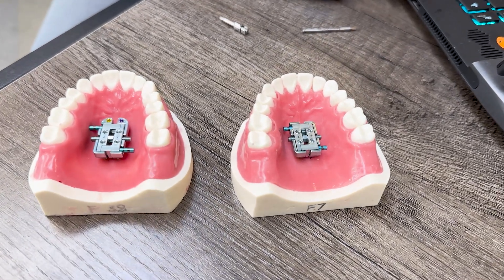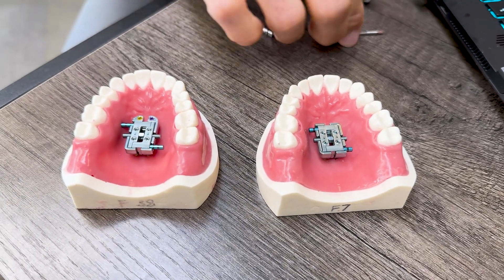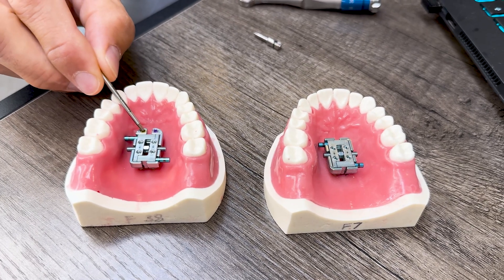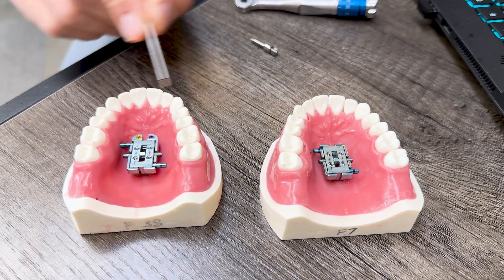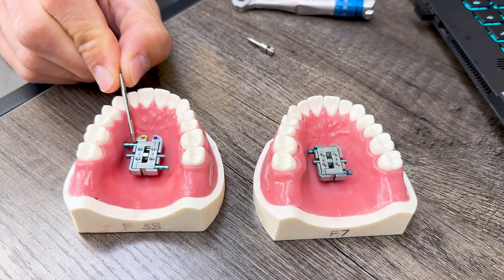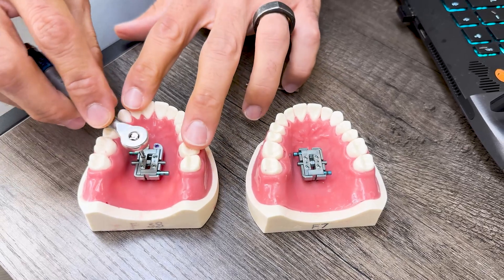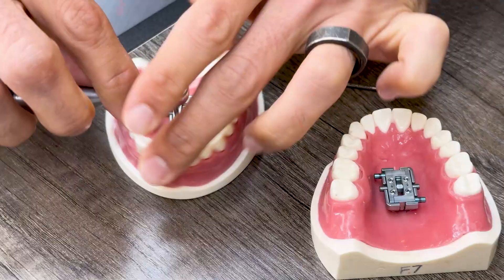These are the current versions of the FME 6 and the FME 8. The difference is that on the FME 8 there are two additional TADs on the anchor body. The middle part is very similar, although the arms are longer on the FME 8. This is something that's customized — when they send you the case they send you the arms that fit for the amount of expansion you are requesting.